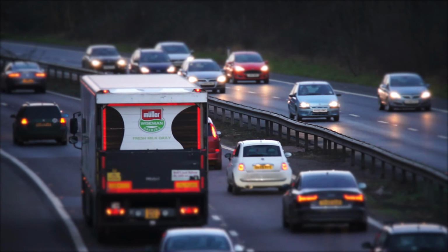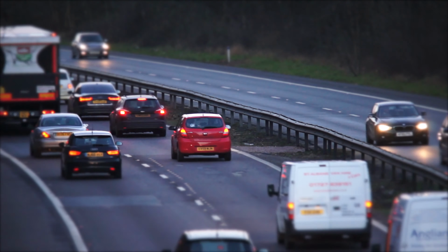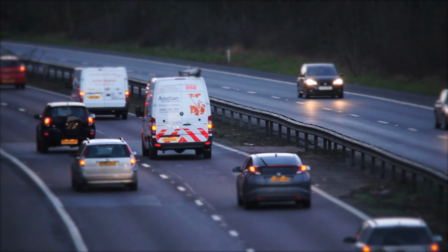They are incredibly sensitive devices, and when you first put them in, you will hear stuff that you haven't heard for a while. I was driving home with them and having to check around as I kept hearing rattles in my car and things that didn't normally sound so loud. That's just my brain making me overly aware of the things that I'm not used to.